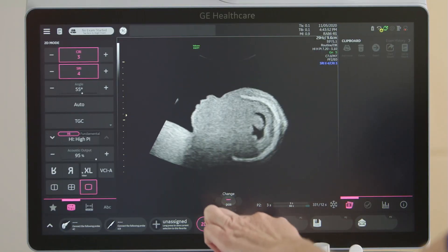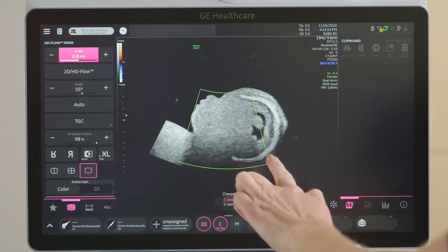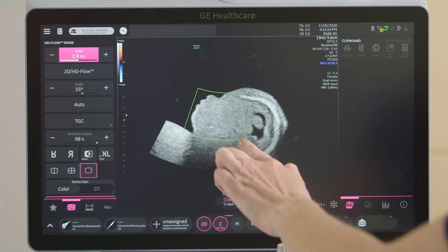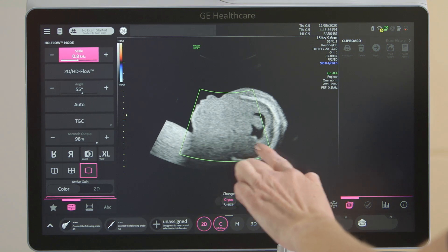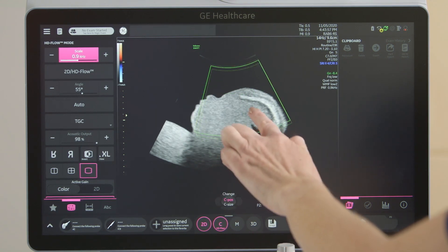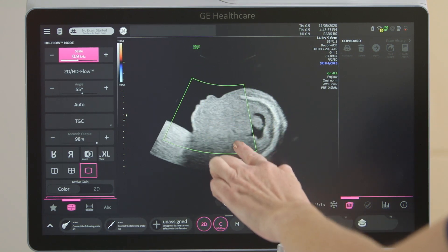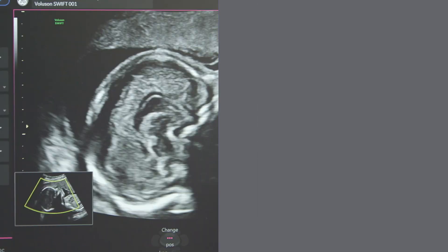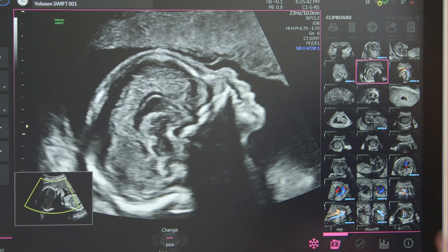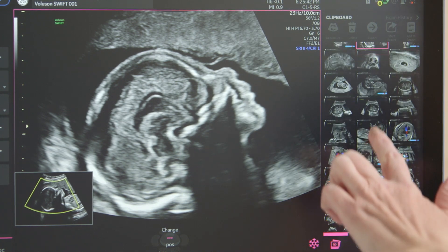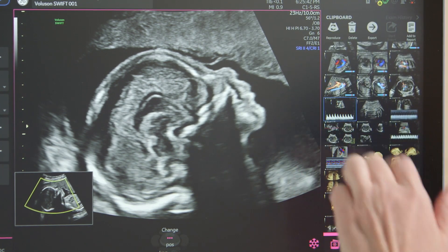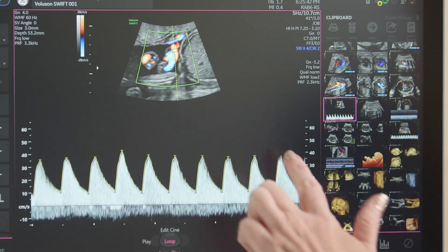Color touch controls include gain, region of interest, size and position. M-Mode, Anatomical M-Mode, and Pulsed Wave Doppler screen controls are also available.